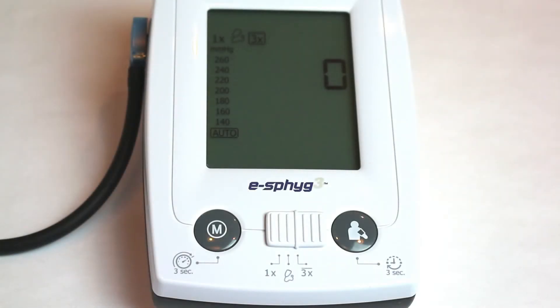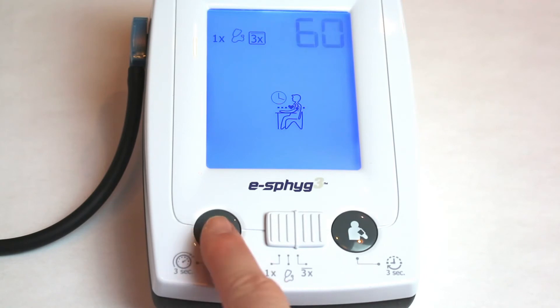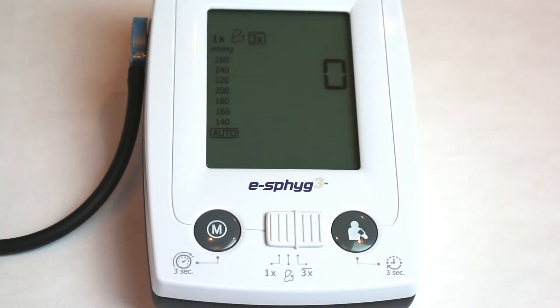You can change the between-reading interval before starting. To do so, press and hold the Start-Stop button for three seconds. The current setting will flash. Press the Memory button to choose 15, 30, 45, or 60 seconds, and then press the Start-Stop button to confirm.